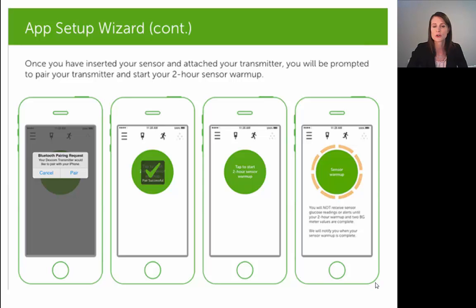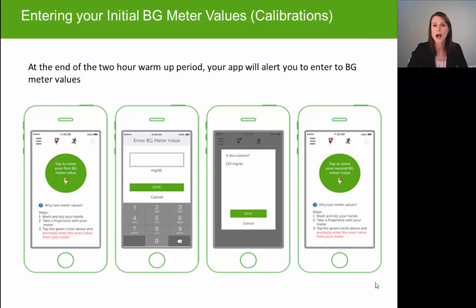You'll then be asked to tap on a green circle to start the two-hour warm-up. The two-hour warm-up period is basically the time it takes for that newly inserted sensor to become fully immersed in the fluid it's sitting in. You won't see any glucose readings during that time, but at the completion of the two-hour warm-up it will ask you to enter your first two calibrations. You'll check a finger stick on your glucometer, manually enter the value, and select save — then repeat that process a second time on a different finger.